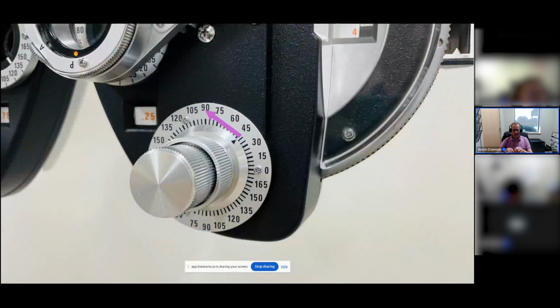And there are actually two knobs here. The knob that's sticking out towards you more is for the power. So the cylinder power is that one, but you have to reach back more towards the machine. And that second knob that surrounds the first knob, you're going to rotate that a little bit. How much you rotate doesn't actually matter that much, but as a general rule, you want to rotate it about 20 degrees if the cylinder power is not very high, meaning it's a quarter or a half in the machine.